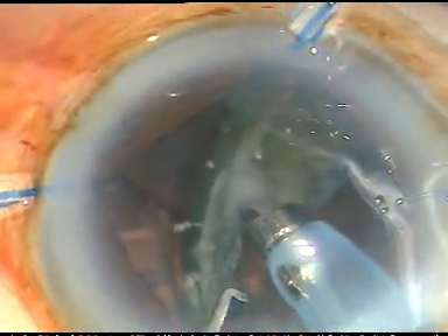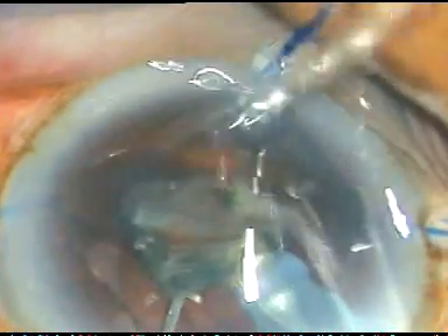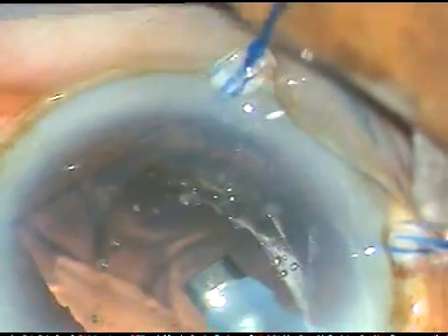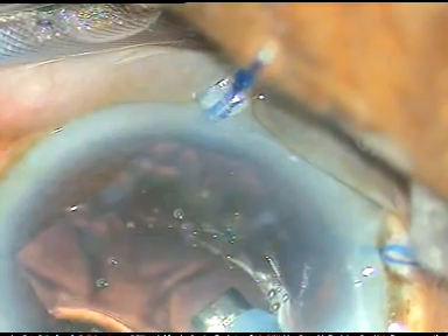In the past it has happened that I removed the epinucleus and the posterior capsule came to the aspirating port and a PC rent occurred. Just imagine — you have placed iris hooks, you have placed a CTR, and now you have a PC rent; you feel so bad. I am happy now that PC rent has been prevented in this case.